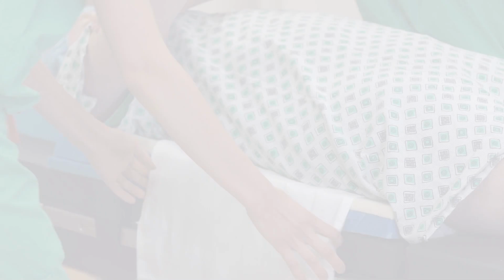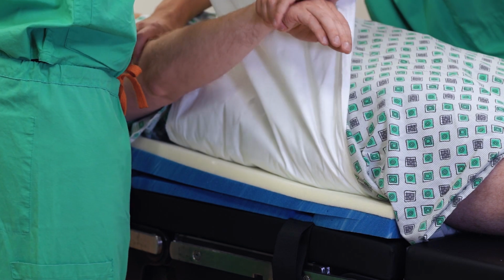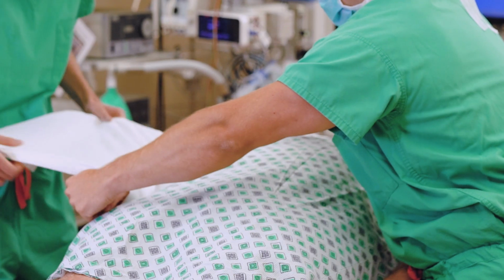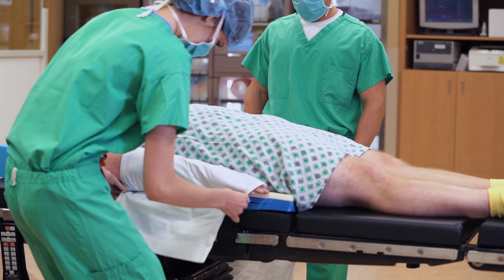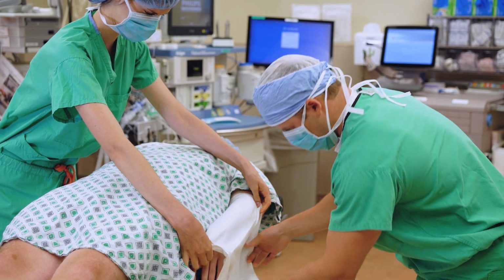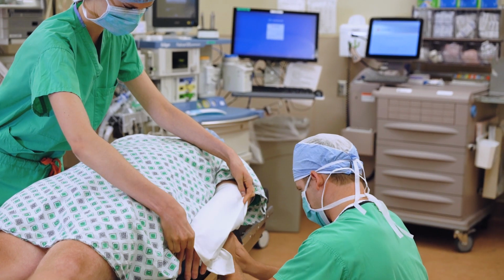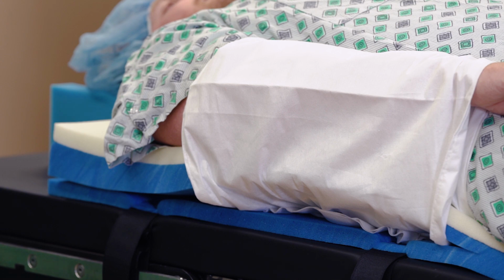with the pad's surface. The sheet contained in this kit is wider than most and can be used to facilitate complete arm support. Once the patient's arms are tucked, the sheet is then tucked into the side slit of the pad instead of directly under the patient's back. This reduces the risk of the sheet putting pressure on the patient if not tucked completely flat.